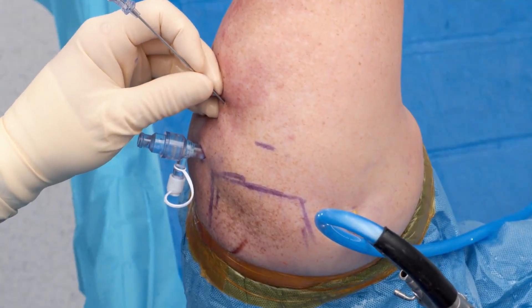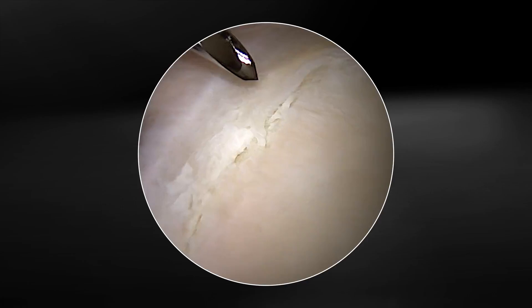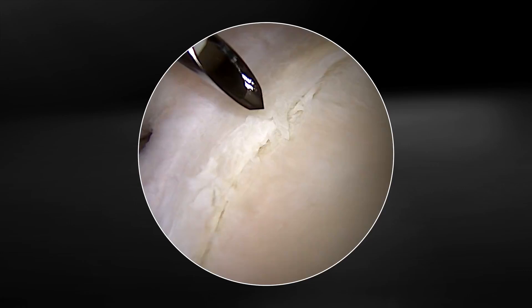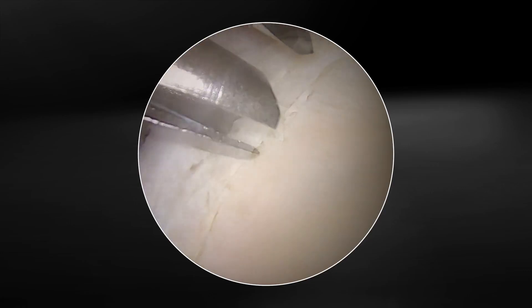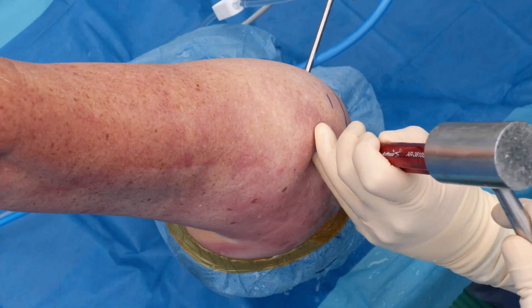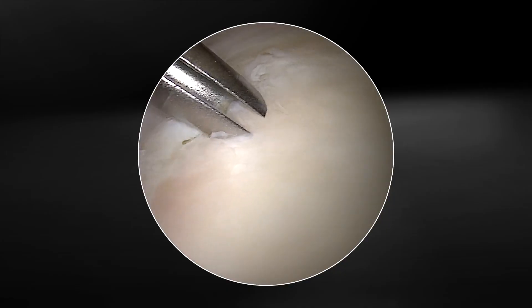I like to start with the spinal needle through the seven o'clock portal. I refer to this portal as the 50-yard line approach, as it provides access to place three anchors without removal of the guide. I start inferiorly to the portal position and give the guide a couple of taps to engage the cartilage so the guide will not slide.